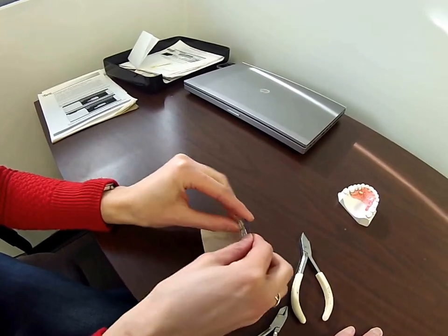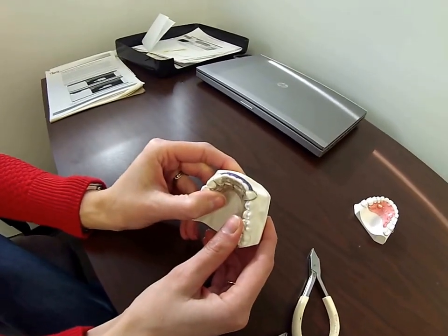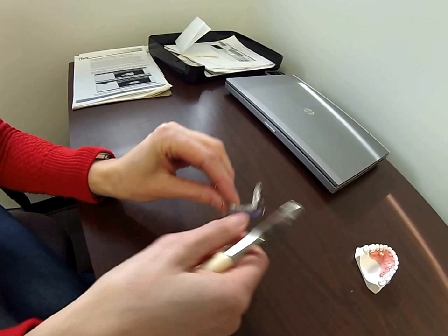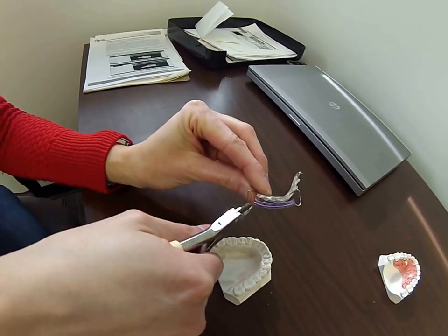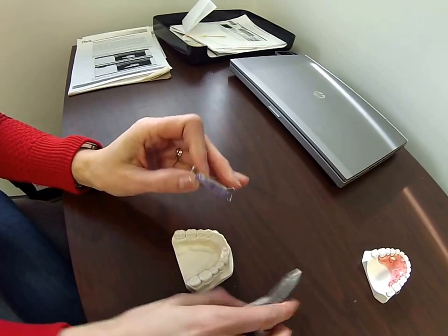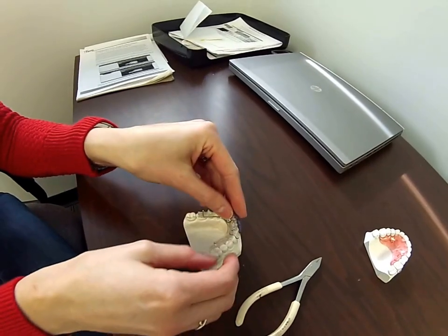Secondly, if the acrylic is away from the teeth still even after you've brought the canines in, the bend we're going to show you is using your three-pronged pliers to tighten up the loops. Keep the pliers at a level angle and make a small incremental bend — let the plier do the work — right and then left, both sides, to bring that labial acrylic in.